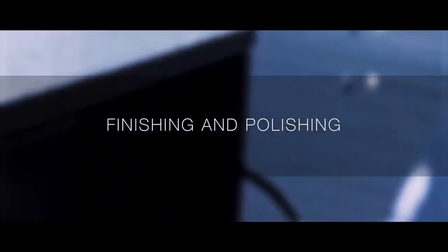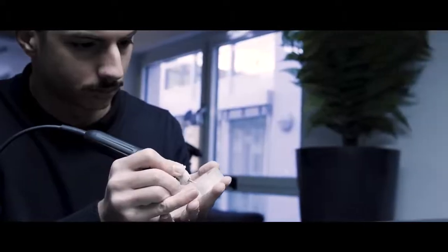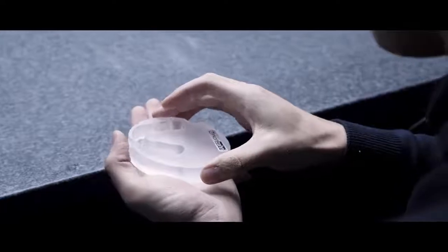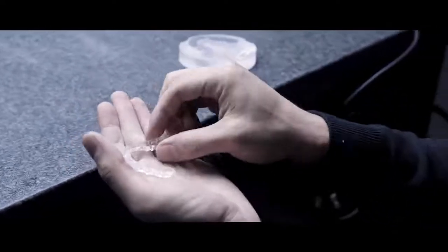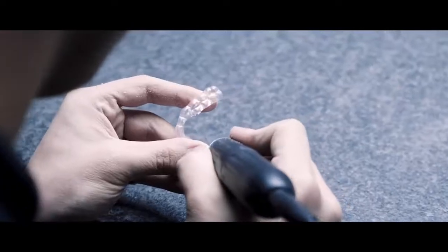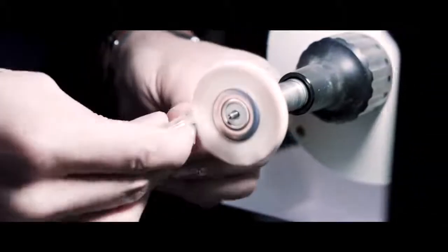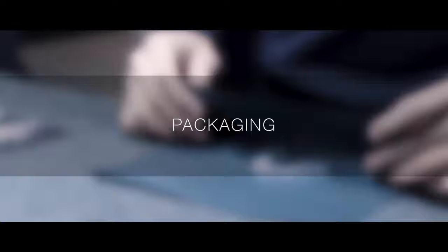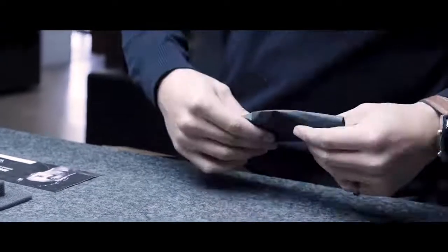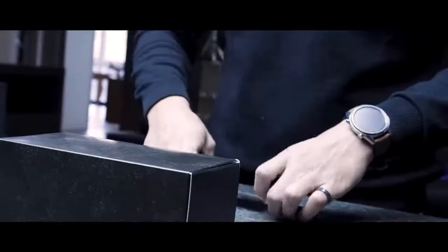Once the milling is completed, we separate the restoration from the blank. We perform the manual finishing with tungsten carbide burrs and proceed with the final polishing. To protect the restoration and deliver it in a personalized manner to the client and the patient, we insert it into a Zirkonzahn box.